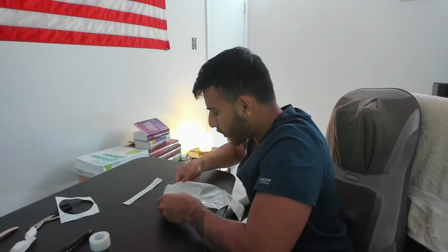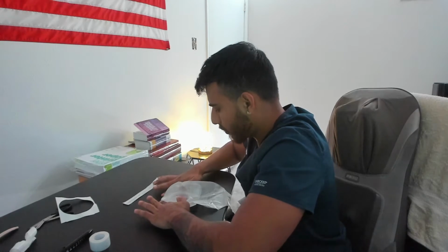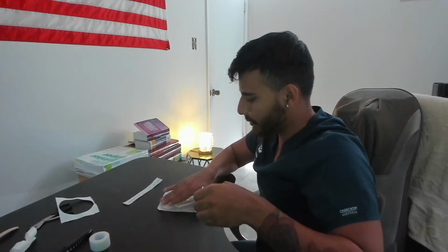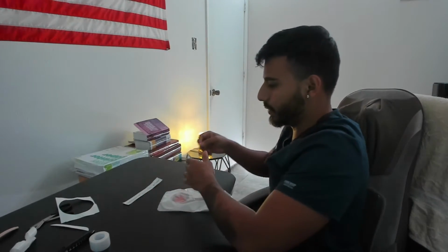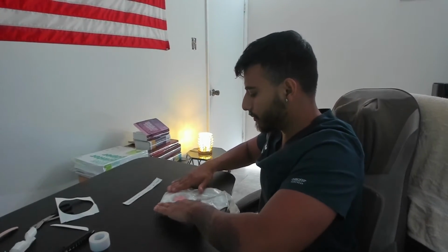And then I'll go right in the middle. There we go. And I will apply gentle pressure until the paste dries. Once the paste dries, give it a tug to make sure the bag is secure.